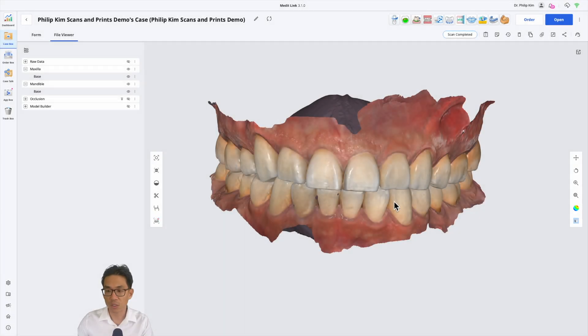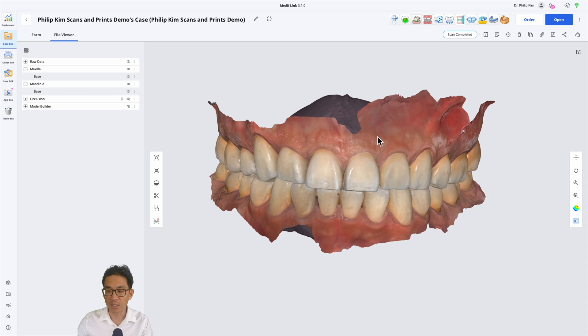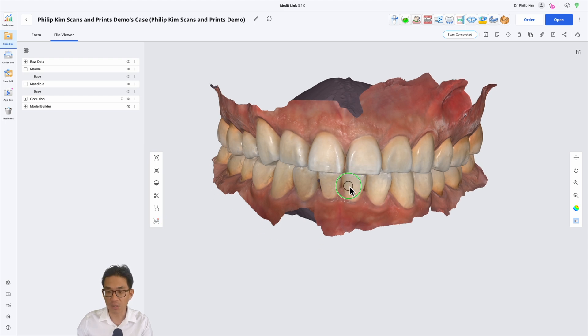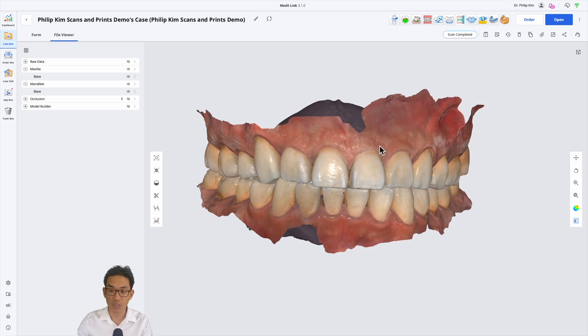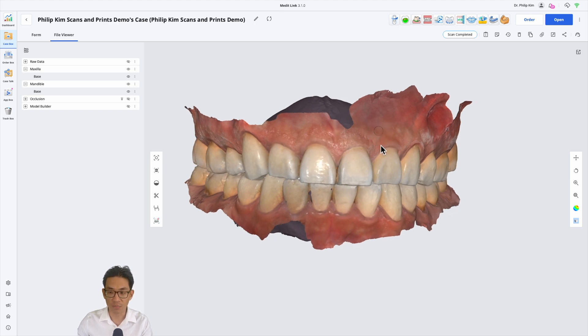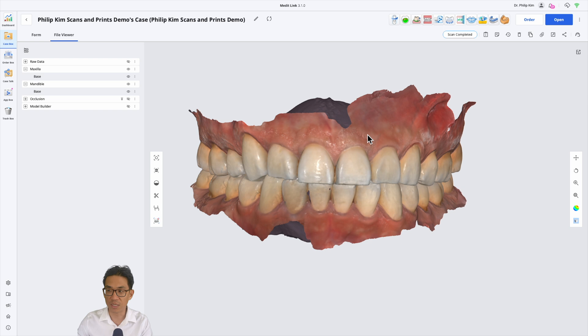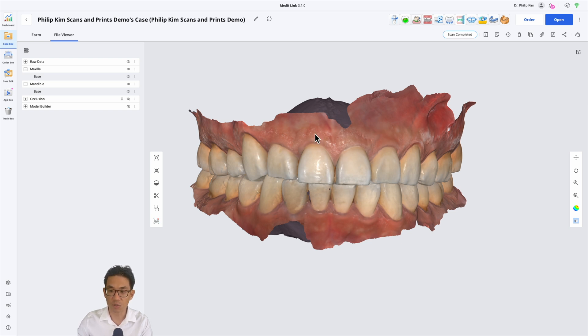In this video I wanted to show you how to make a night guard using free software, Medit Splints. You don't need a Medit scanner or even need to pay. You can download the software for free and I believe you get 10 gigabytes of cloud storage that you can use for cases.